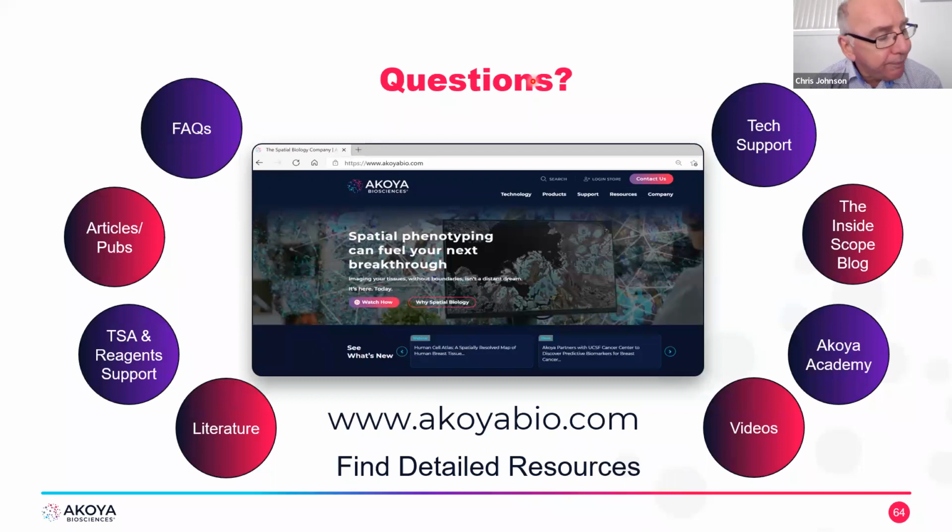Okay, thank you. Another question is, which chemical bond of the epitope does the fluorescence bind? Sorry, can you say again? They say, what area or which chemical bond of the epitope does the fluorescence bind? Oh, okay, yeah, right. So the fluorescence part will bind to protein structures that are very, very close.